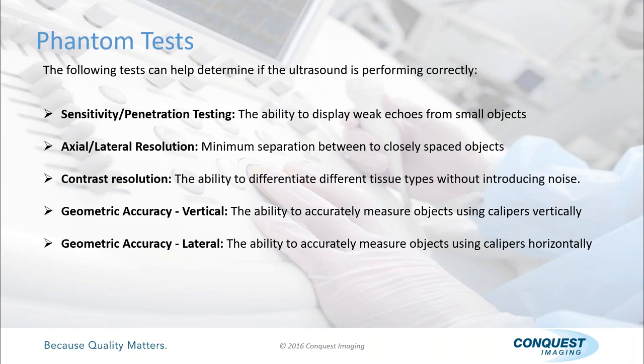However, I got a call from a fellow engineer who did. I want to point it out because this has been happening more and more regularly, and I don't know the engineering behind it. I wish I did. Somebody would like to explain it to me someday. On pediatric measurements, they changed the average speed of sound in human tissue. But because the software for the calipers is developed on normal studies, it throws the caliper measurements off when using a pediatric study.